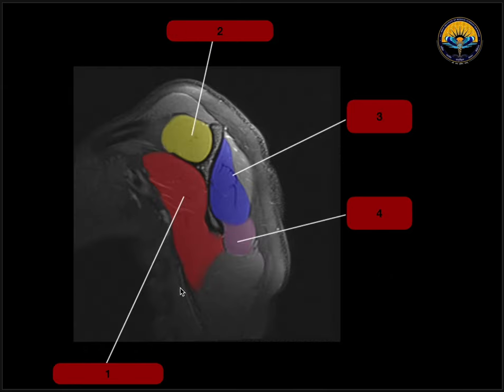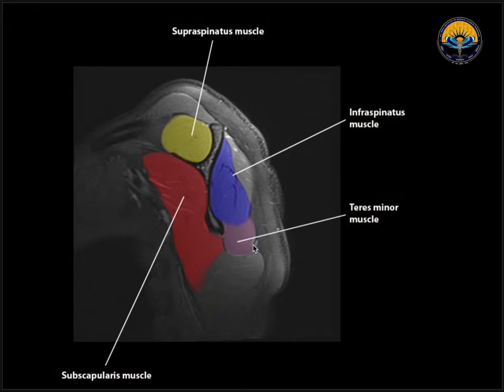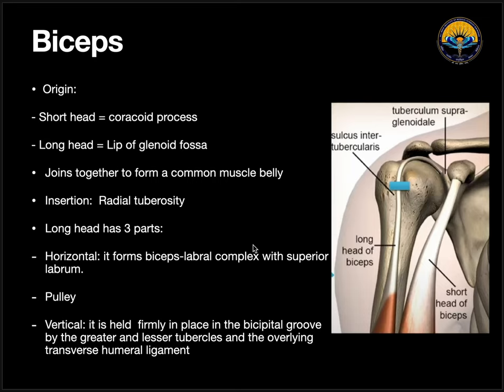Now coming to the sagittal sections. Here we can see the scapula and the spine. Anterior to the scapula, we will see subscapularis. Above the spine, we will see supraspinatus. Below the spine, we will see infraspinatus and teres minor. Now we have seen the coronal, axial, and sagittal sections. Now we will talk about the biceps.